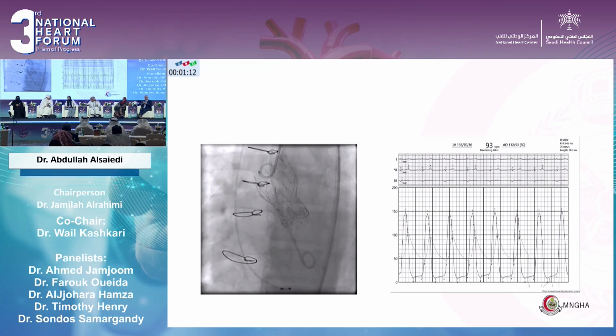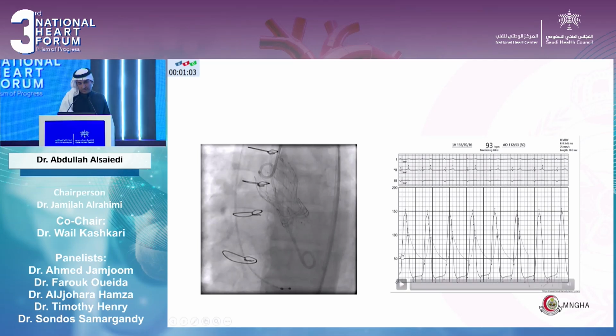As you can see, sorry for the quality, because this is from the cath lab print sheet. There is around a 25 gradient after we put in the valve, and we did post-dilatation with a semi-compliant regular Crystal balloon. At this stage, we were expecting that.